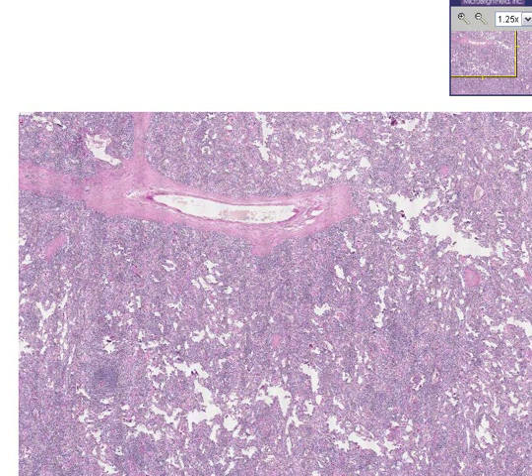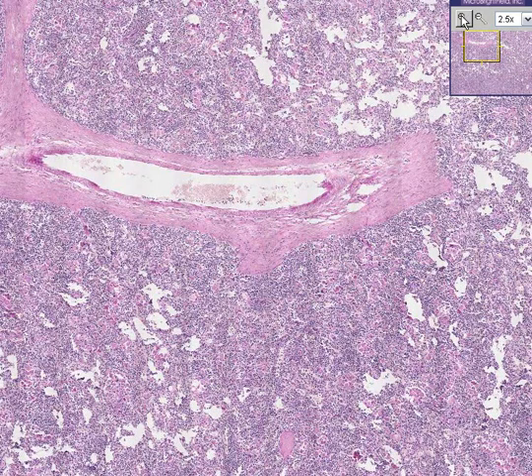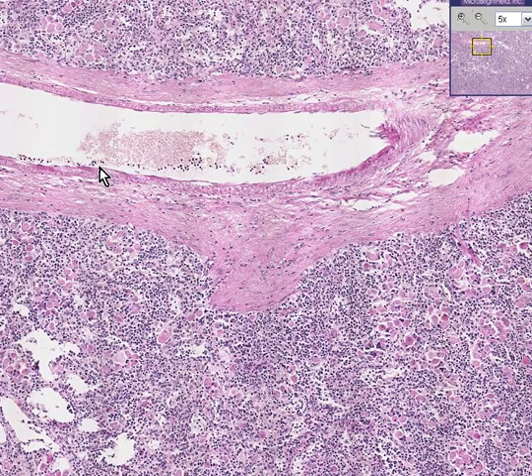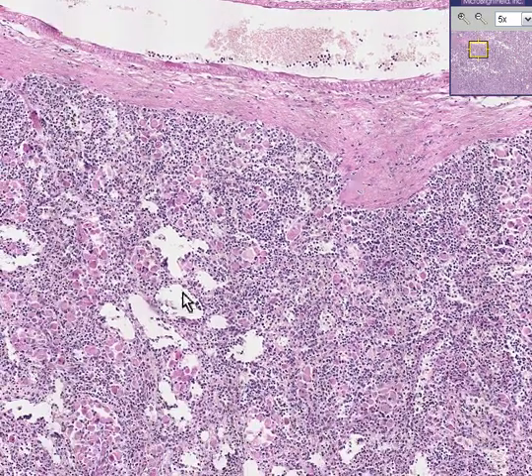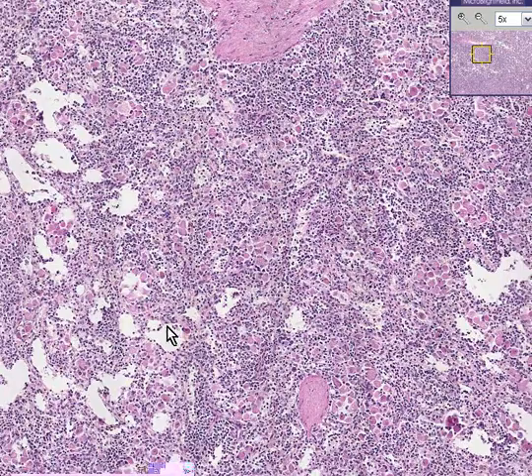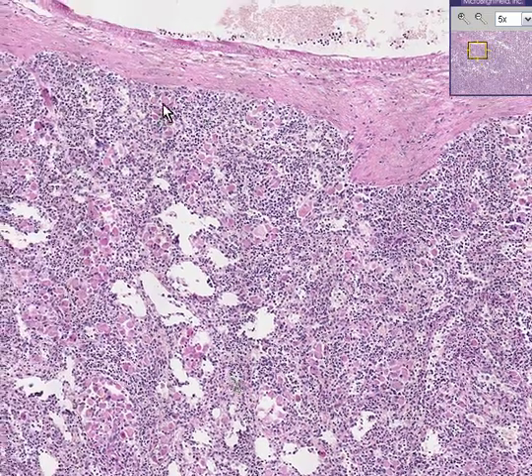Can you recognize this as being spleen? Perhaps you can, because you can see that there is a large blood vessel running within this fibrous trabeculae, and you know it's a blood vessel because you see smooth muscle and a lot of blood on the inside, red cells here, white cells here, surrounded generally by lymphoid tissue, but also having the sinusoids, so classical for the spleen. So this would be the white pulp, and this would be the red pulp.